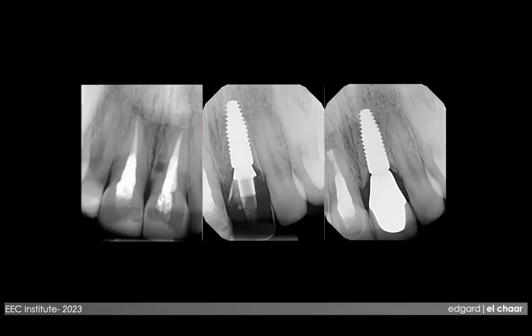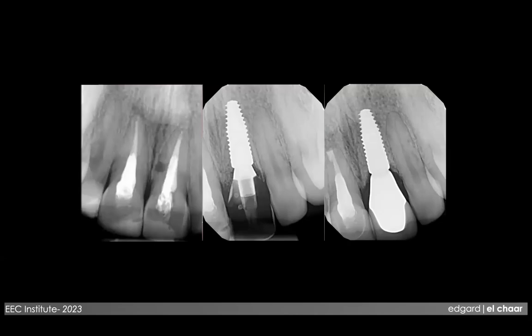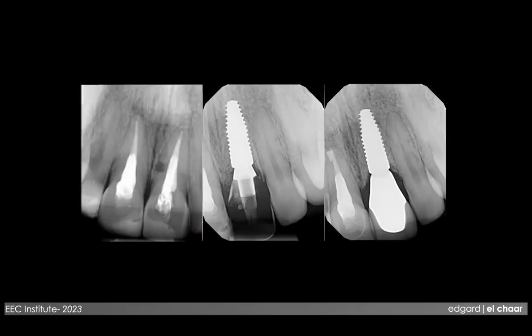And that is not only one case. Now I'm running another prospective paper, with already 200 implants placed immediately, posterior and anterior, and using the guided surgery. And we closed it now. We are just following the cases, and we are 2 years in it as a prospective, meaning moving forward, and that's more the accuracy of the things. And we have a success rate of 97%.